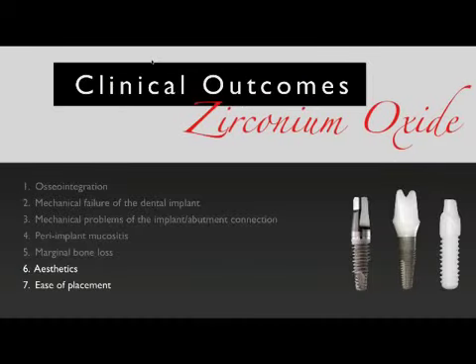And then the aesthetics. Everybody believes that that is the most important reason of why we're using zirconia, because it's white. I demonstrated that health of tissue came before the aesthetics and the ease of placement. But at this point, I want to explore a little bit about how beautiful these results can be and how simple the restorative or prosthetic process is.